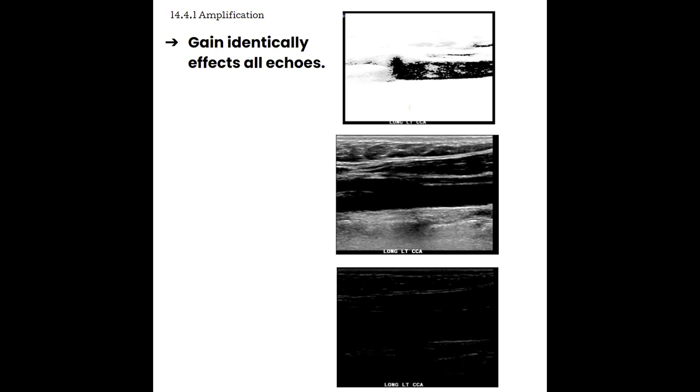During pre-amplification and amplification, we are changing the intensity that the machine is displaying those echoes at. So when we have a change in numbers, like we do with amplification, we are seeing a change in decibels. So amplification is measured in decibels. So remember that both power and amplification or gain are adjustable by the sonographer, and both can make the whole image brighter. But increasing the power increases risk for bioeffects. Increasing gain has no effect on the bioeffects.